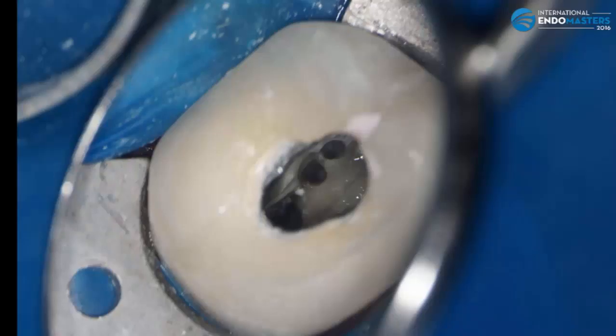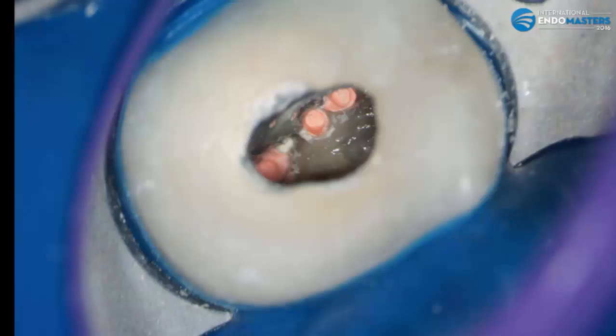Also, to my surprise, the instrument came out very deformed after the first insertion. This is what the file looked like. At this point, I did not take a working length X-ray. I finished obturating the canals. We have two distobuccals and the palatal.